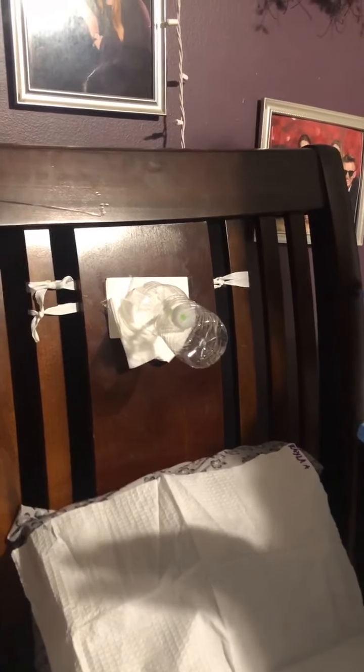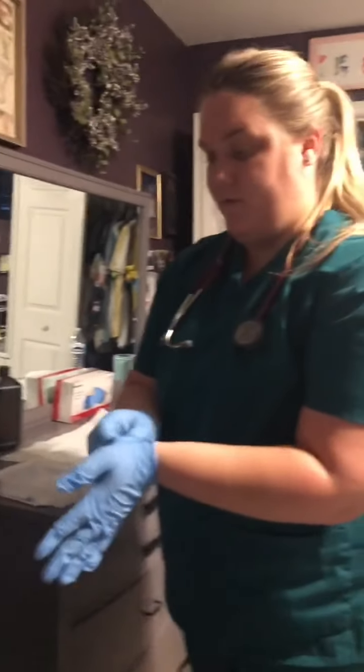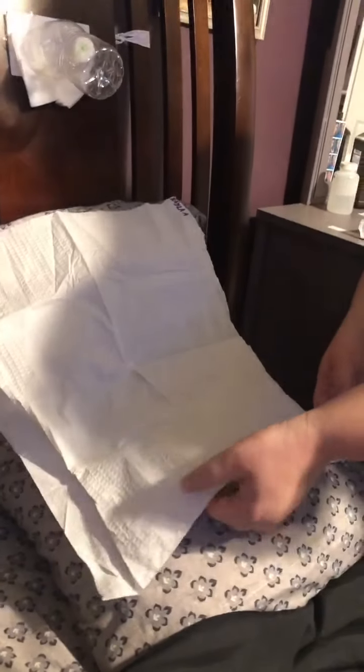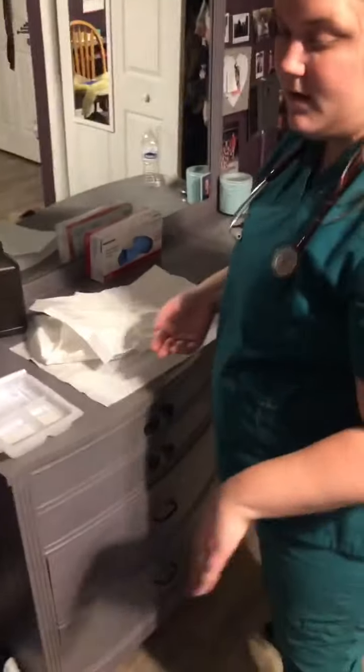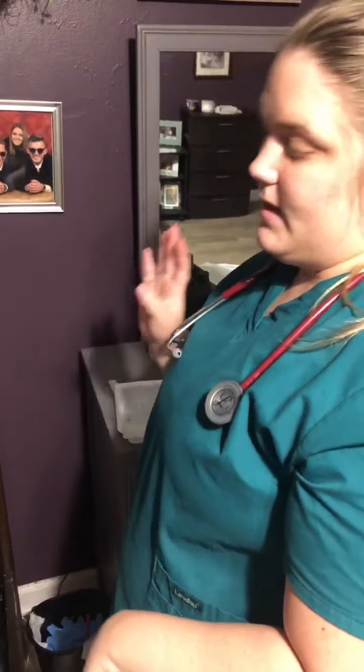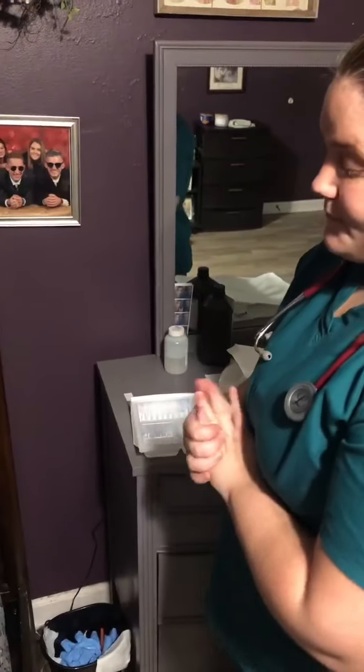So now my patient is all cleaned up, trach care is performed, and so I would remove my gloves, the ties would be removed, and this doesn't have any secretions on it, so my hands are fine to touch it. I'm going to clean it out, and I put my patient in the lowest position, make sure that the bed is locked, that they have their call bell in place, and then I would wash my hands.